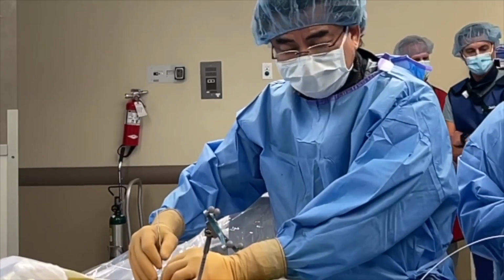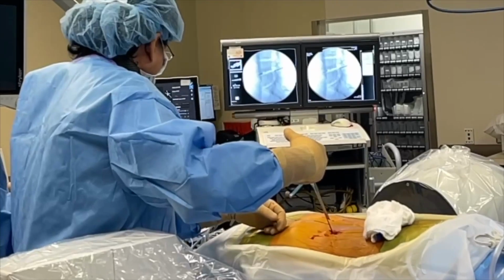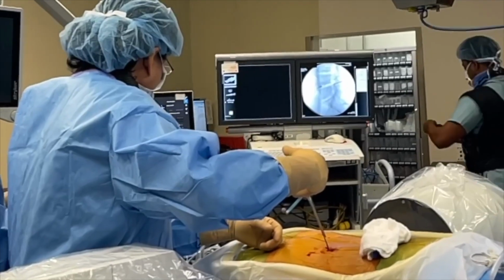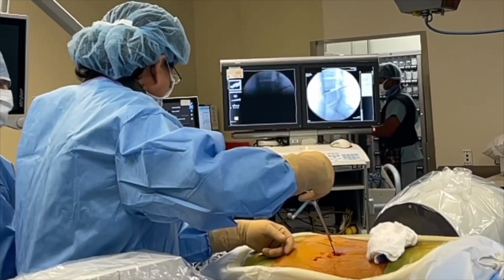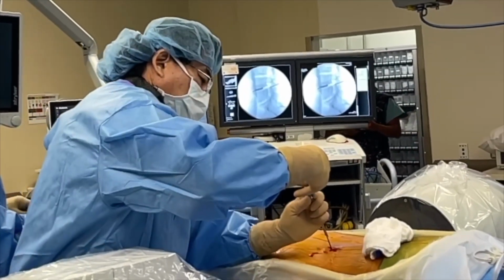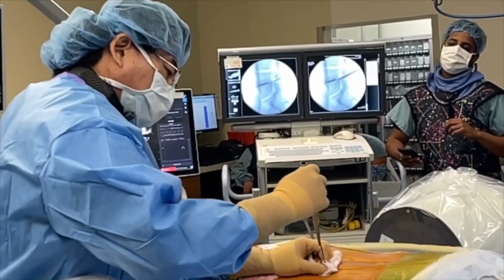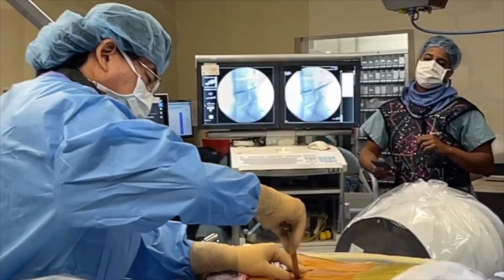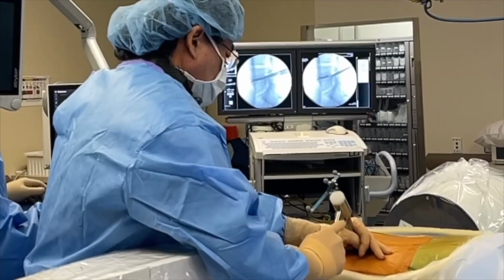Okay, Brittany, I'm entering the neuroforamen and loving it. Oh yes, injecting the dye into the disc, which is completely caca poo poo also. Thank you. Brittany's calling out the neuromonitoring. I've got every piece of technological advancement I have in my tool bag. This is called the Wolverine. This is going to protect the exiting nerve root. Shot.